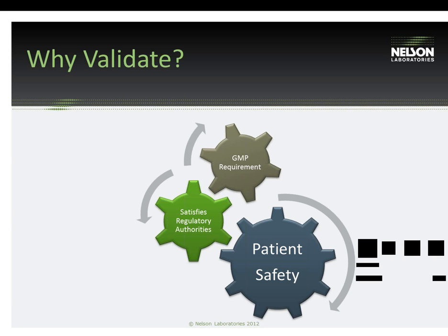A lot of people call and ask, why do I have to do this testing? This is regulated, and there's a regulation on these validations. Along with that regulation, it doesn't talk about what types of residue that you should be concerned with or limit values or acceptance criteria, which makes it difficult for the manufacturer. But hopefully this presentation will give you some tools and tips to use on how to design this cleaning validation.